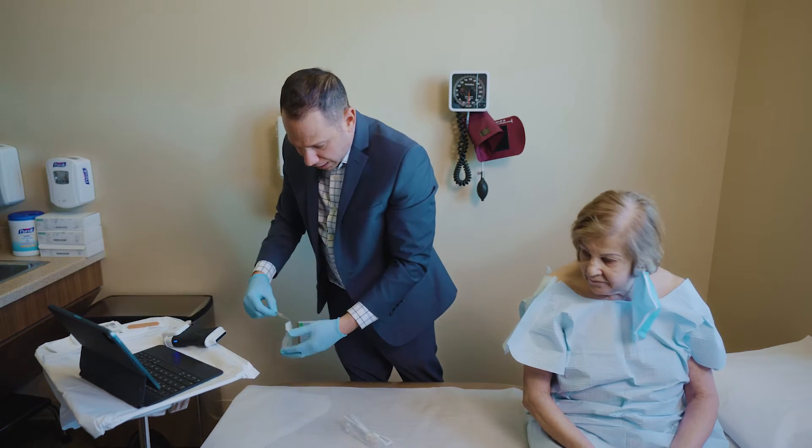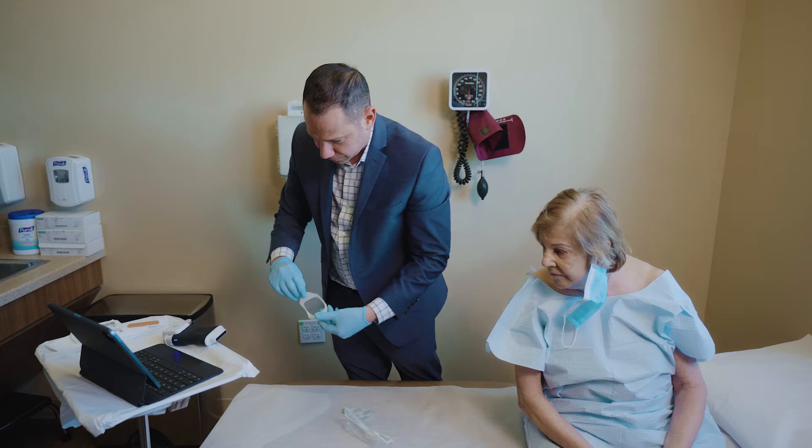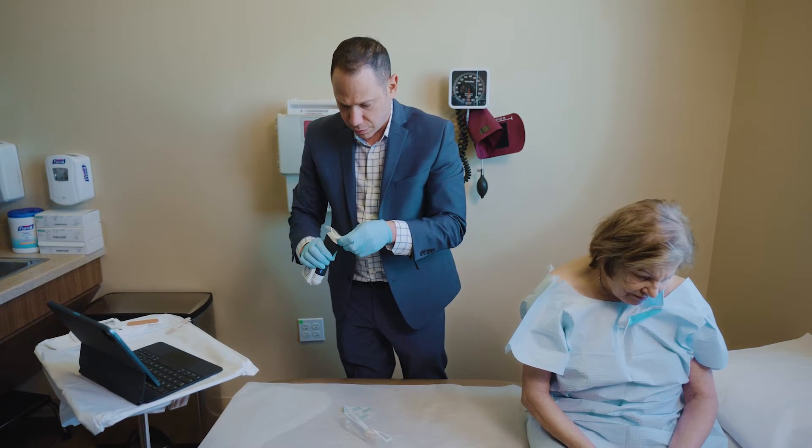Hoda, from 0 to 10, how bad is your pain? She reports about 7 to 8.